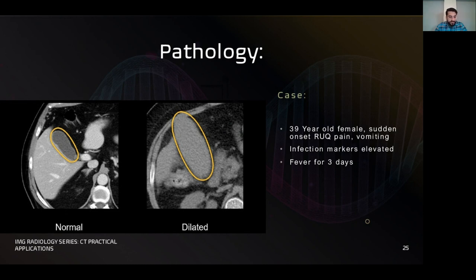mucosal enhancement, thank you. That's good. So surrounding the gallbladder, there's going to be signs of edema, exactly, and possible obstruction of the cystic duct. Yep, correct. That edema and signs of inflammation or infection essentially present as what we refer to as stranding. And stranding is a concept where you see different shades of gray, essentially, that show edema. So you see some darker, more hypo-intense shades compared to some lighter shades.